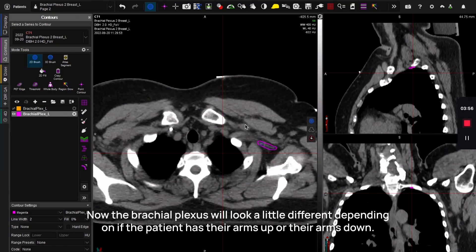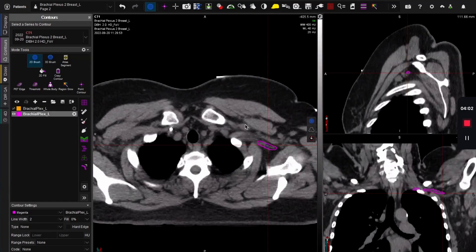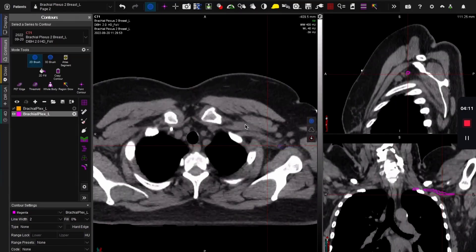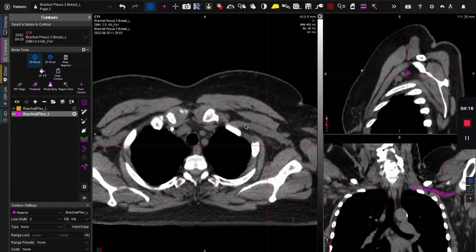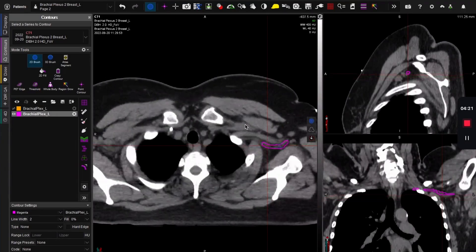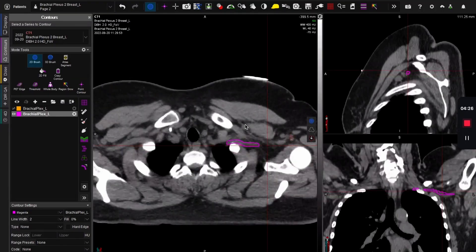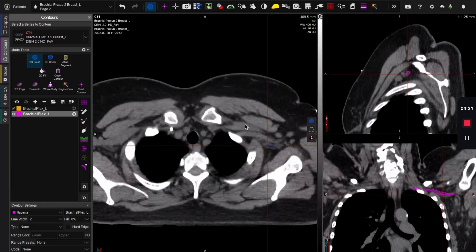The brachial plexus will look a little different depending on whether the patient has their arms up or down. This is a breast cancer patient with her arms up, so we're actually going to stop seeing the brachial plexus if we go down far enough — because her arm is up, it won't be there anymore. When contouring as an OAR, we usually just go down to its lowest point and don't contour it as it continues upward.